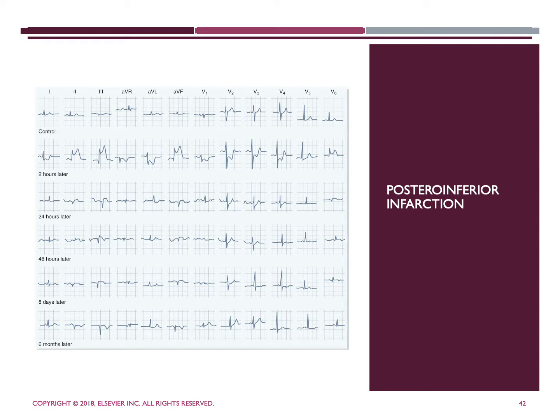Once again, as you're looking at this, you'll see the top one is our control. You'll see the word control just below it. Then you see 2 hours later, 24 hours later, 48 hours later, 8 days later, and then 6 months later, just so you're getting a better understanding of how he's explaining those and what you're looking at throughout it.